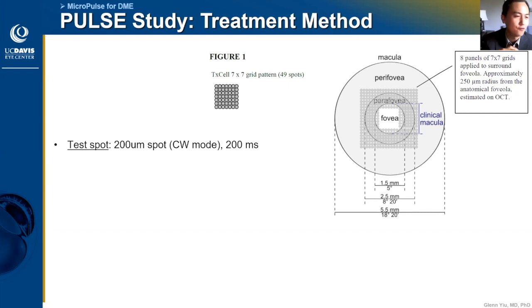So I think it's helpful, at least for our clinical trial, that we want it to be absolutely safe and we have this whole titration method. But I think in normal clinical practice, as Dr. Horstman said, it's great to just stick with a general number that you can use on everyone. But at least for most of our patients currently, I like to standardize things with our protocol.